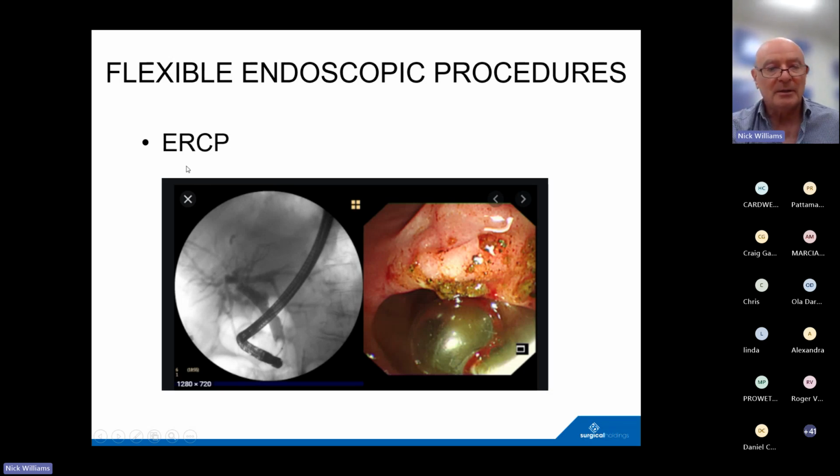That's an example which I explain in terms of the ERCP. Endoscopic retrograde, looking back, so it's through an endoscope, looking back. Cholangio is the biliary system here, pancreas is the pancreas, and ography is fluoroscopy. So that's a through the scope image using fluoroscopy.